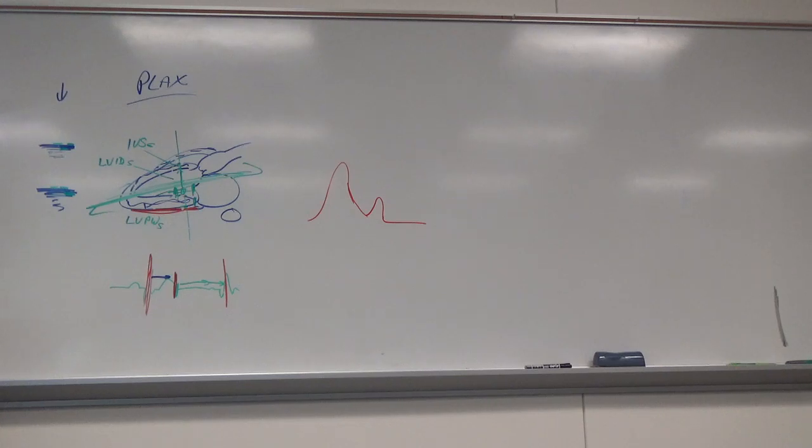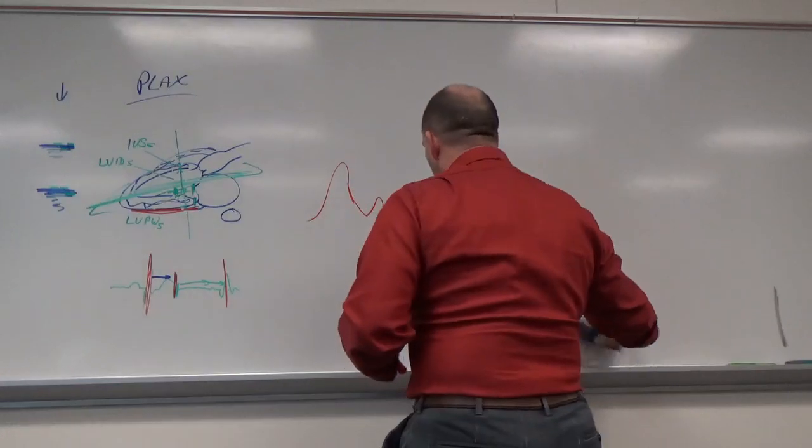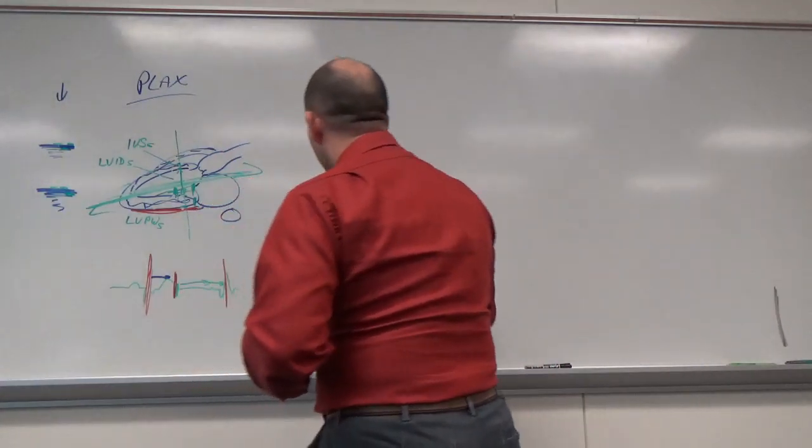So we are also going to do M mode. So what is M mode? It's motion mode. Good. How does motion mode work?